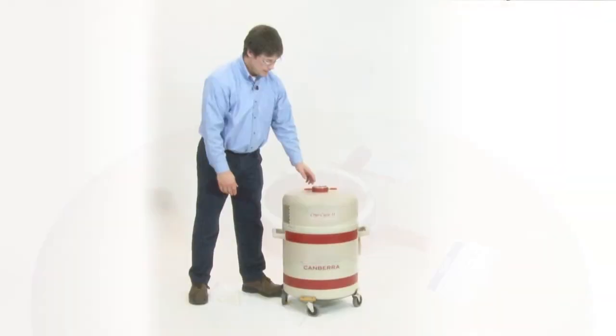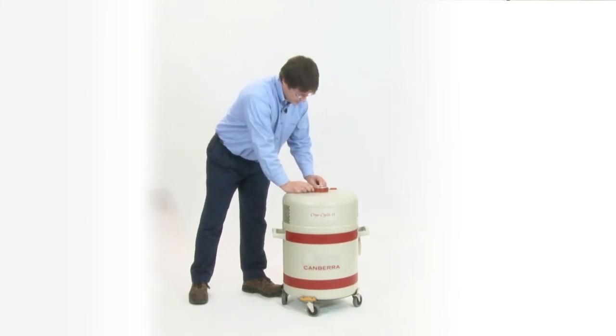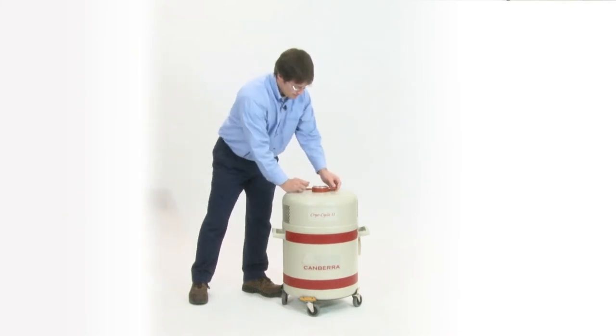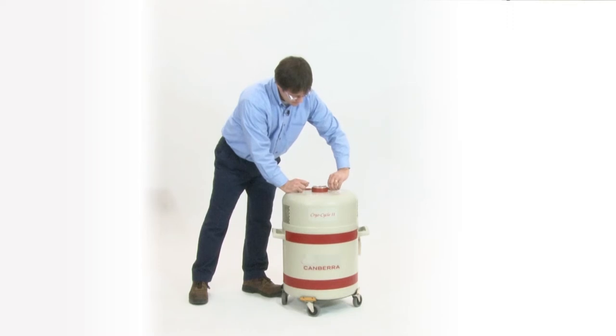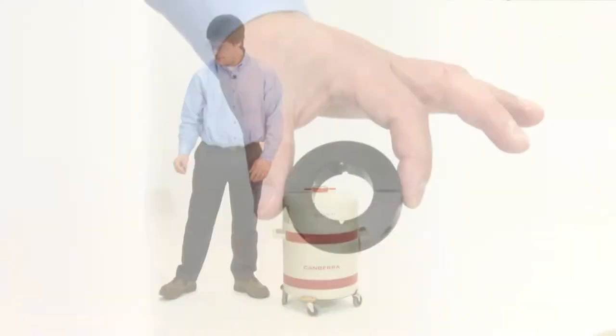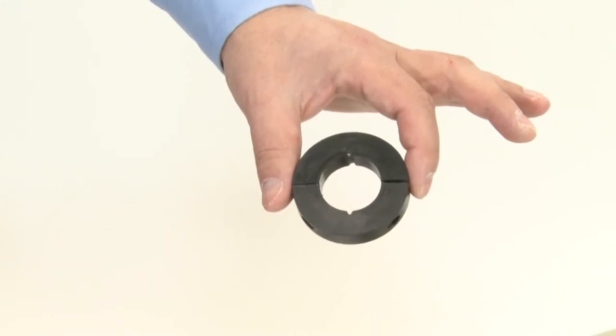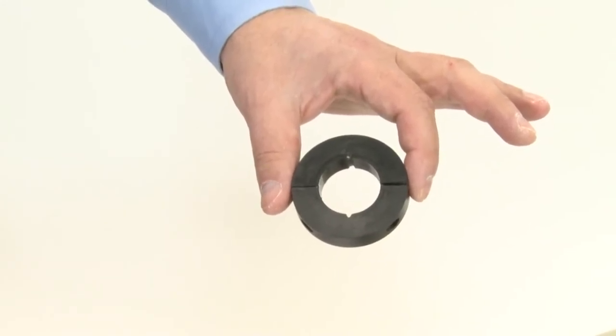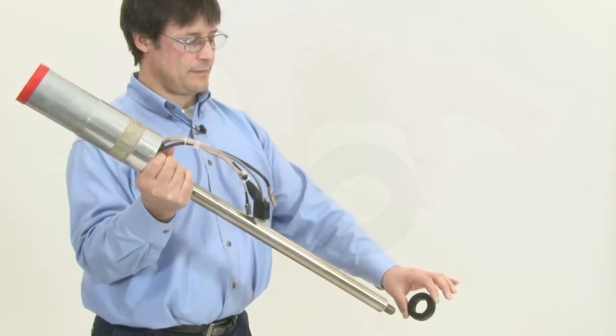The next thing we'll do is we have to remove the vent plug because when we put the dipstick into the system, the gas that's displaced needs to vent. Before we put the dipstick in, we need to put our Delrin collar on. So you can just slide that on first.